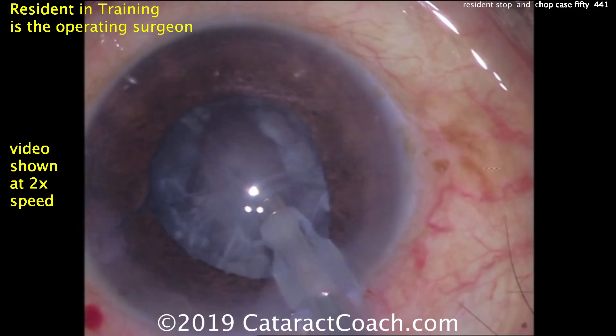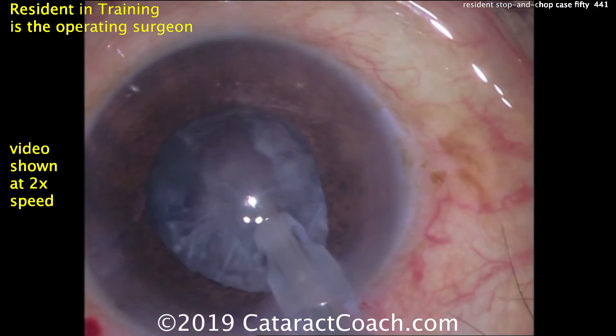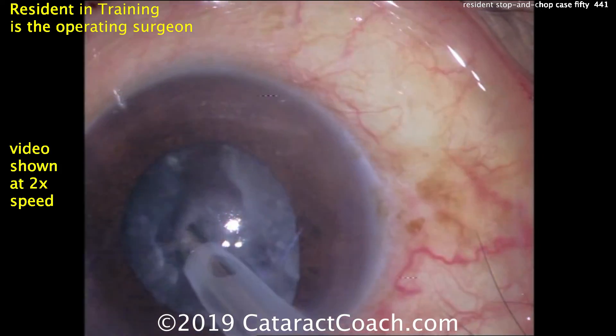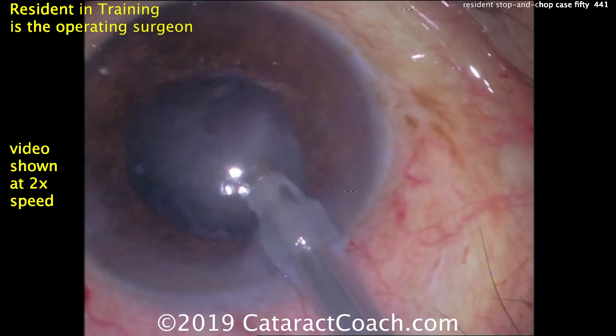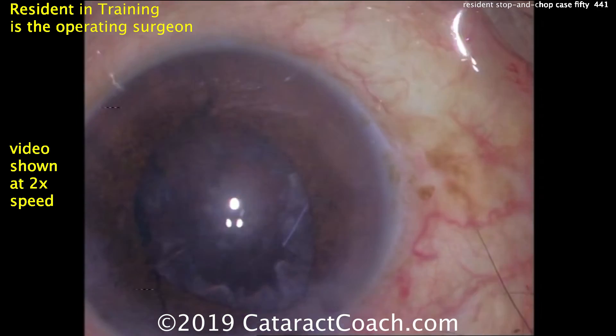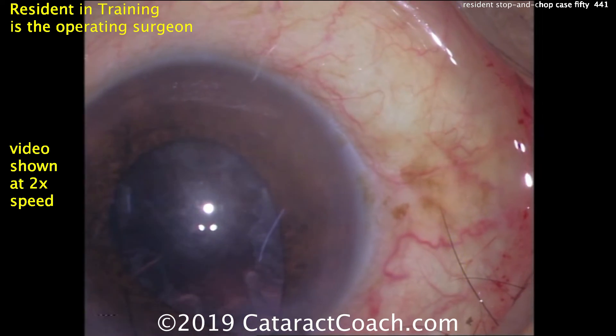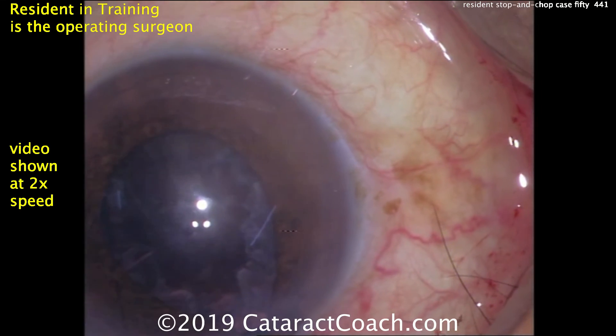There's an epinuclear shell that remains. Let's see if we can get that out with just the phaco probe — the key is to catch it with a little bit of vacuum, just like that, and it can be emulsified. That went great. Now switching over to do cortex removal with the irrigation aspiration probe, and so far this case is doing great.